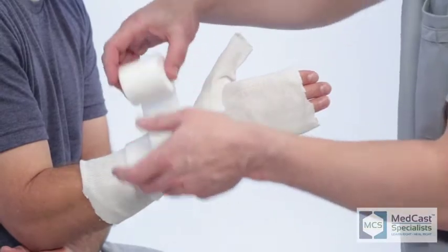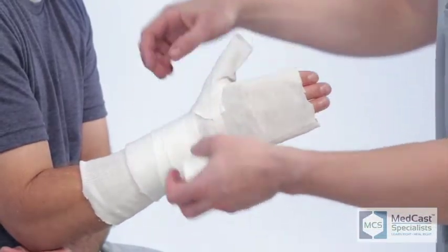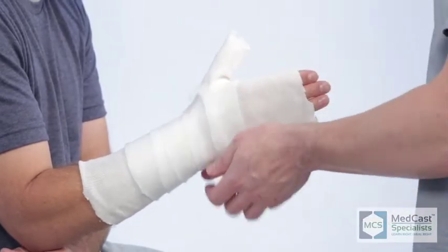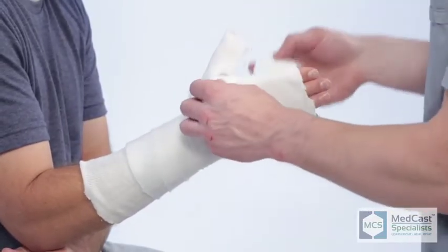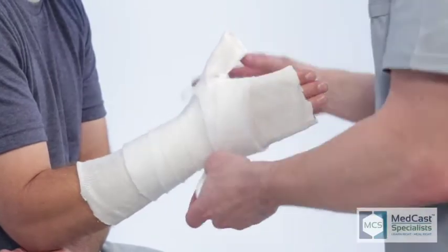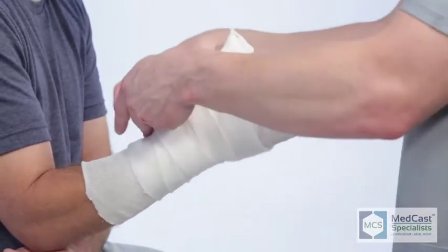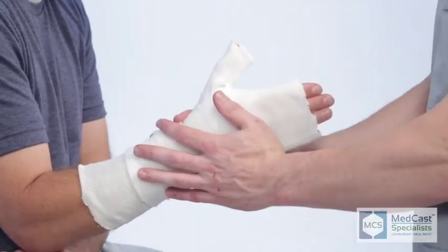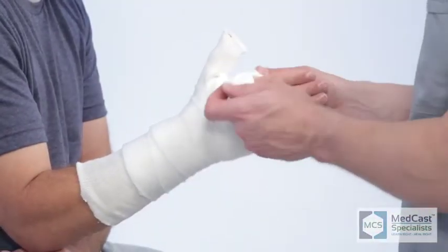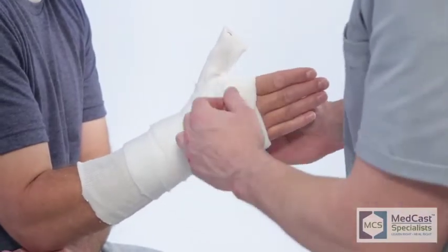This is kind of a two-step process we're talking about. You'll see how we fold the stockinette back here. These are just some of the tricks we've learned to make the application a little bit easier. Sometimes you get perplexed when you look down and you say, how am I going to put 2 or 3 pieces of stockinette on this and actually make it work? We get a lot of great feedback on these casts, especially if they've transitioned from a splint to a cast. They always say the cast is much more comfortable.